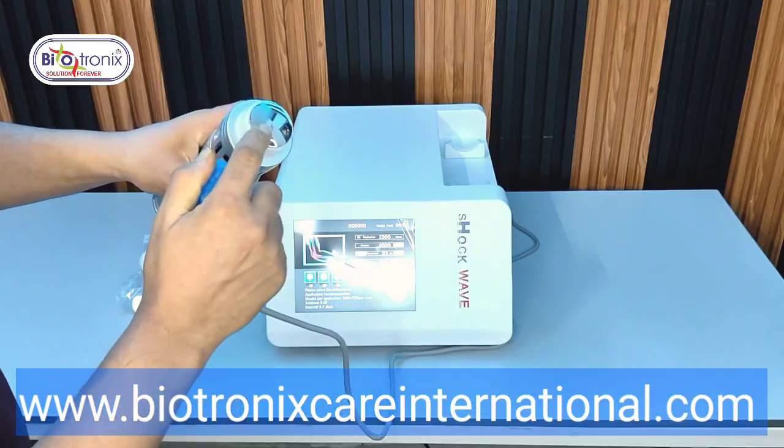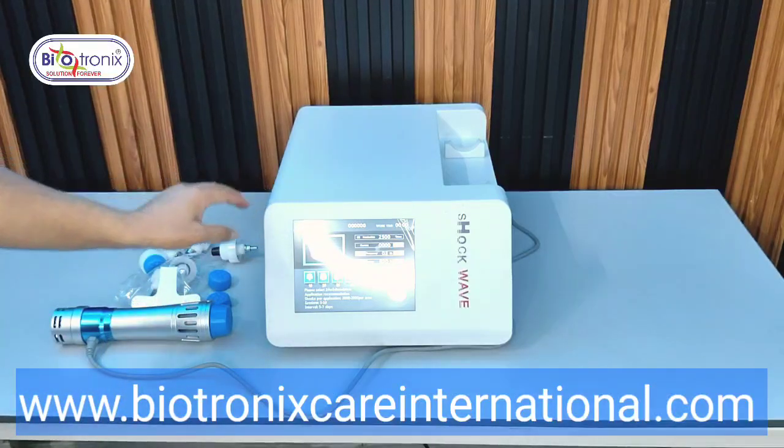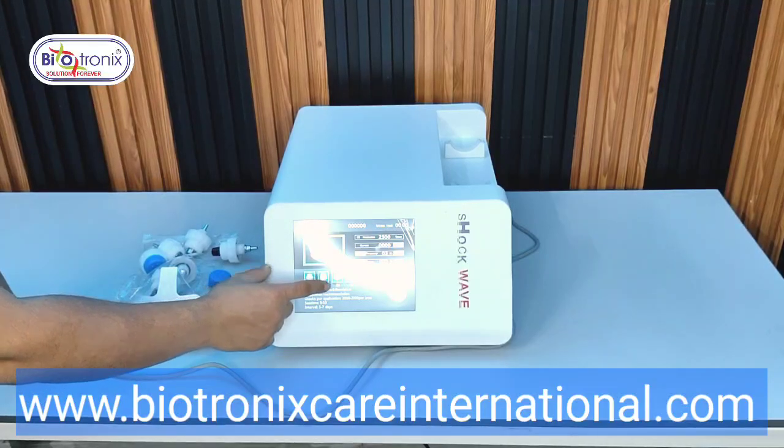You can see this is the bigger one. So there are 7 different transmitters, 7 different hand pieces you can change. So now you can see in the elbow section there are second and third, which are in the yellow color.